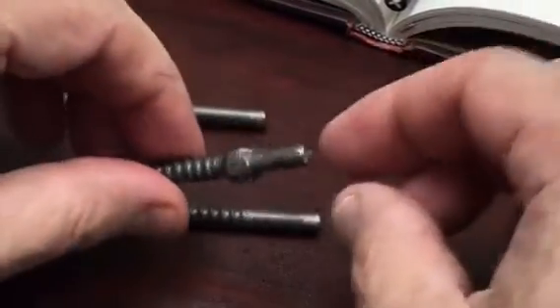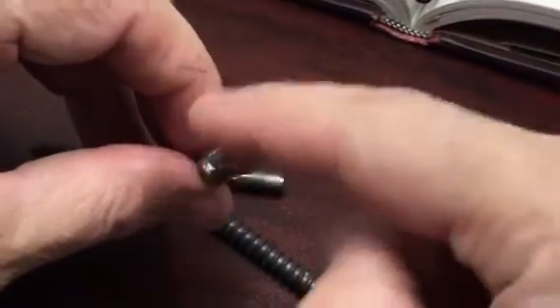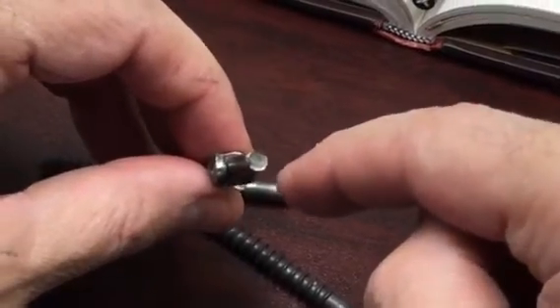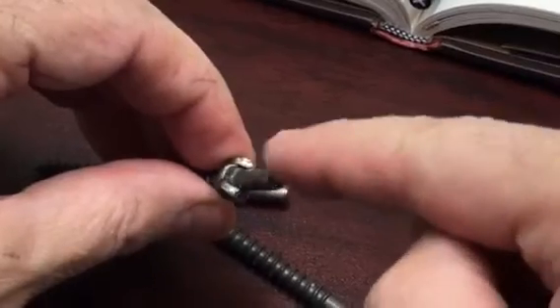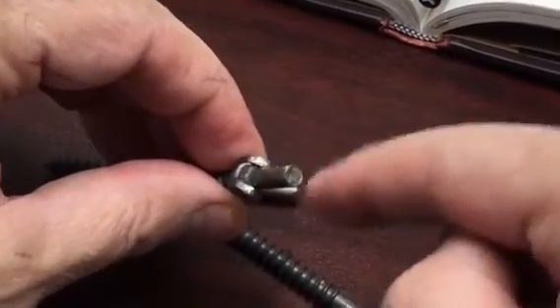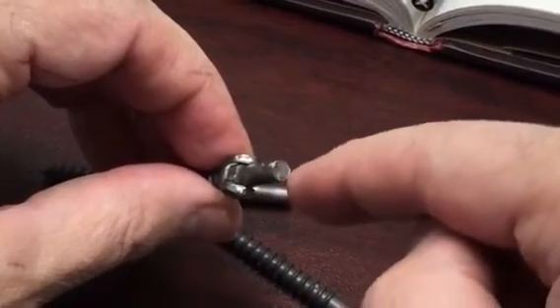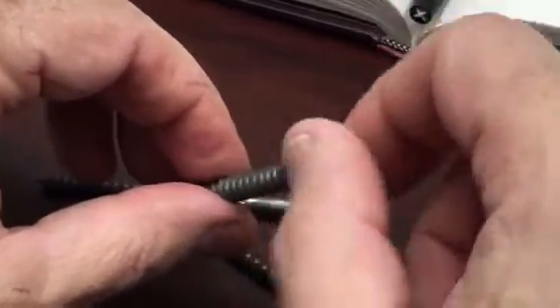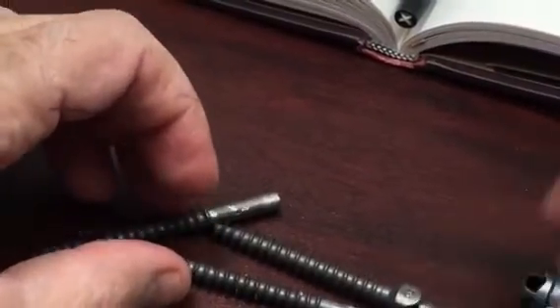The other thing is this is a reduction screw, and if you have to remove this, they have a driver which did not work during my case — I'm not sure why. I had to remove it with a reverse screw removal set, the Synthes reverse screw removal set. It was a five millimeter, and you just go around and it finally catches and spins the screw out. Again, TSRH 3D system.